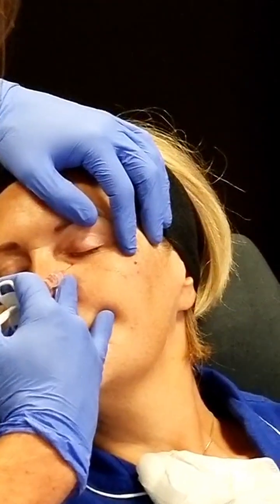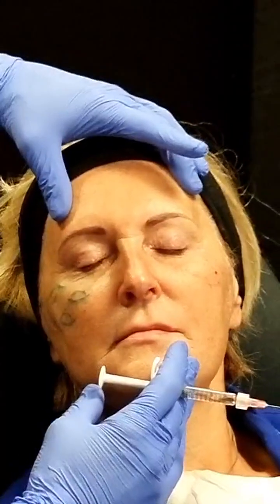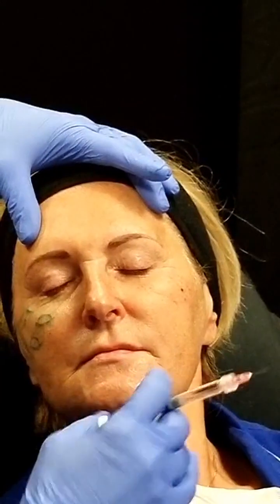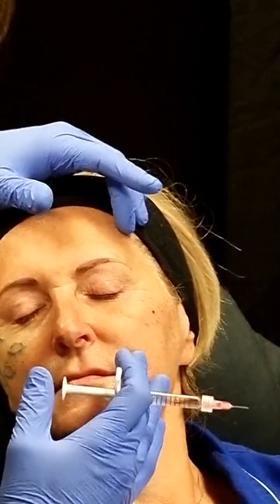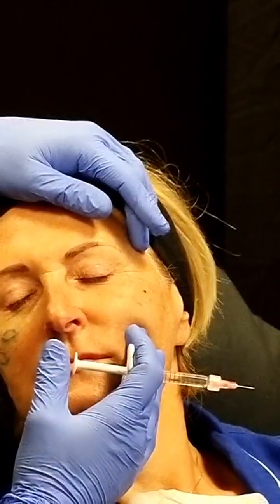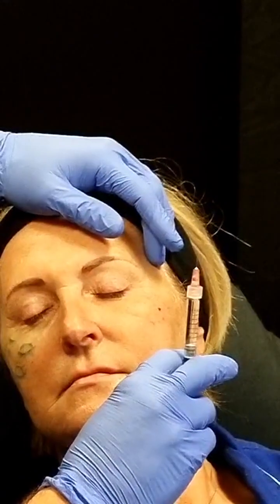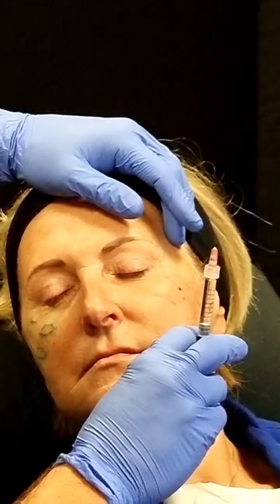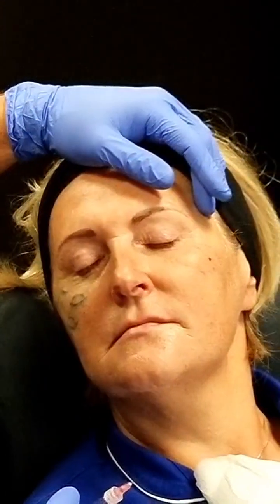Tom, I have a question from the audience. How much is the quantity of the product that you have used so far? I mean, the volume? 0.1. Sorry? 0.1. Okay. So, nothing. Yes. You don't need much to strengthen.